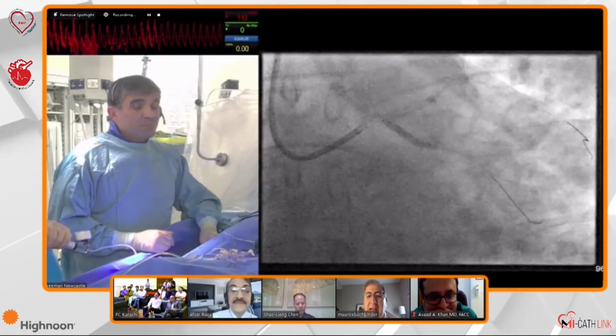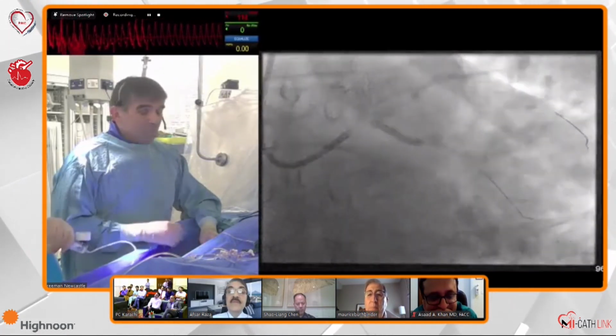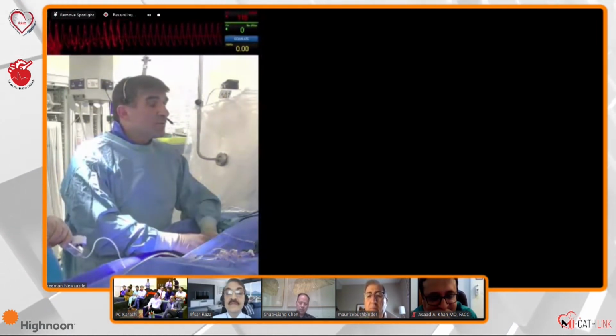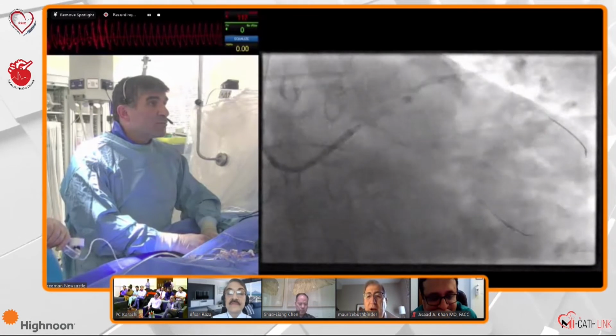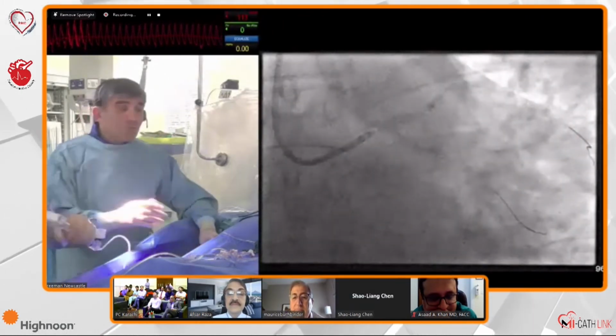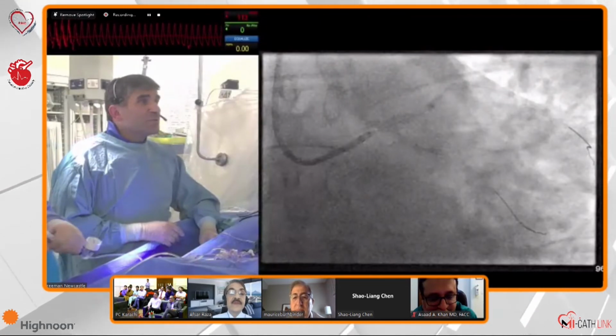I would take it as high as I can. I think this is most important for you. So go up to 2, maybe almost 3.25, just to make it bigger. Up there. Across. Yeah, I mean, we're going to 16 atmospheres.